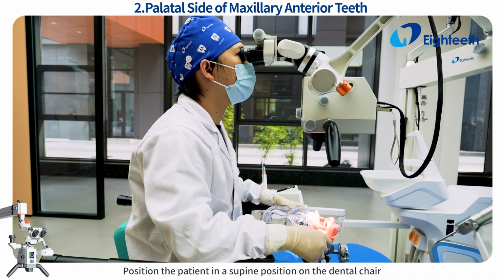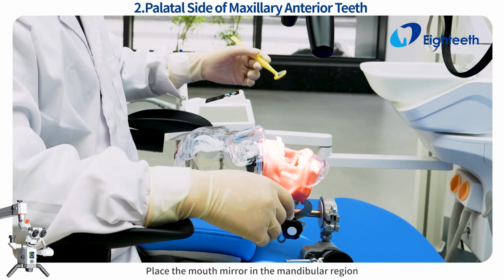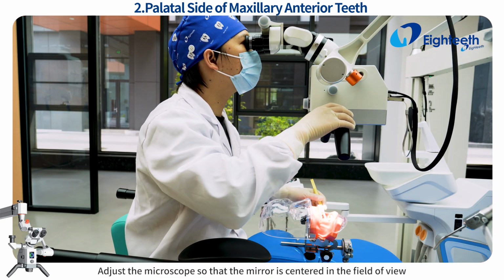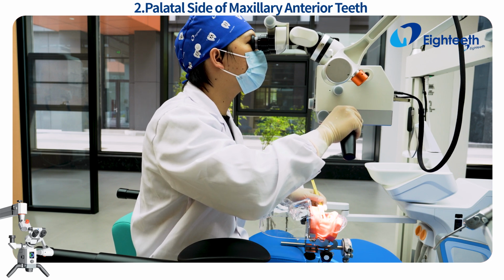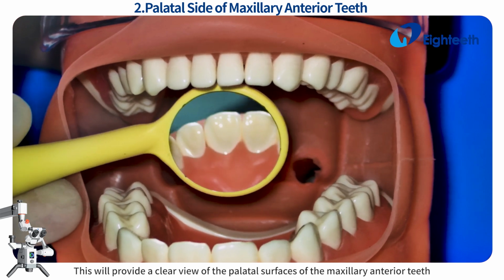Position the patient in a supine position on the dental chair. The dentist should be positioned at the 12 o'clock position relative to the patient. Place the mouth mirror in the mandibular region. Adjust the microscope so that the mirror is centered in the field of view. This will provide a clear view of the palatal surfaces of the maxillary anterior teeth.